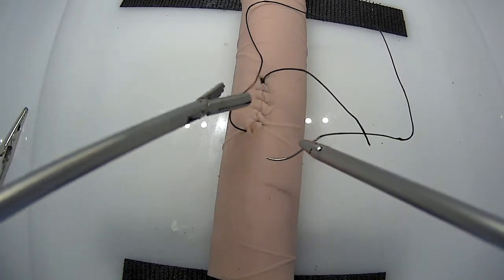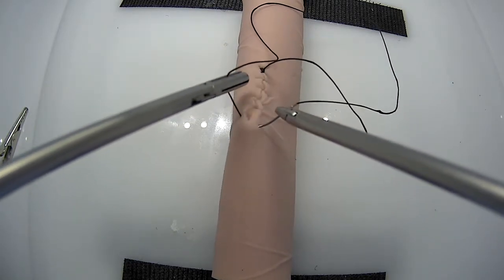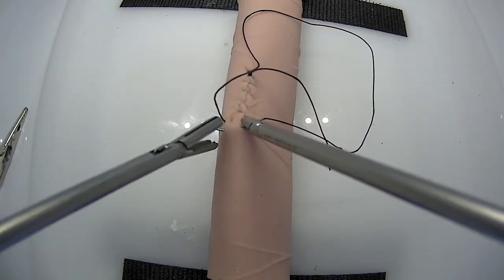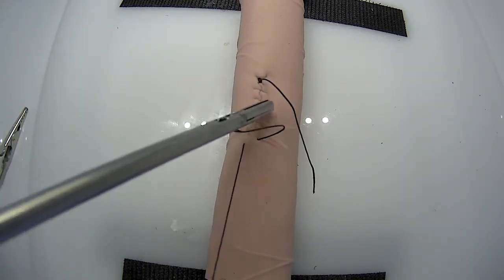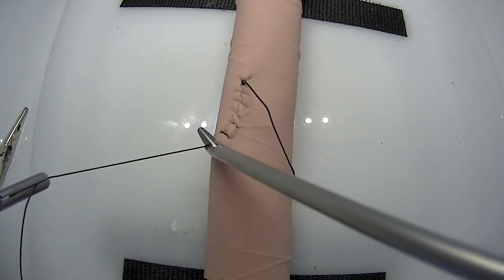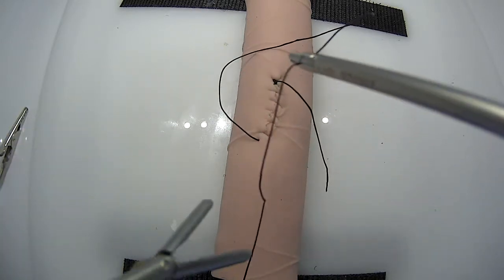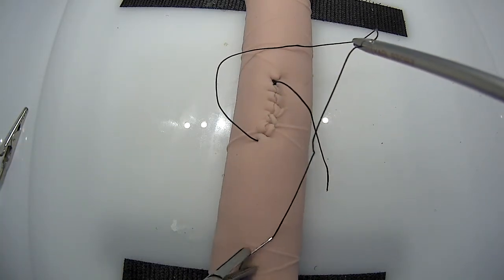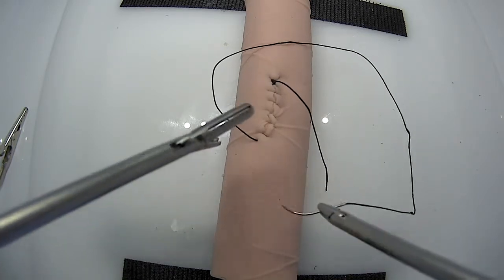You're going to want to continue the suture past where the enterotomy ends. This will ensure that you close the entire thing. It's good not to make this layer too thick, otherwise you start imbricating way too much.